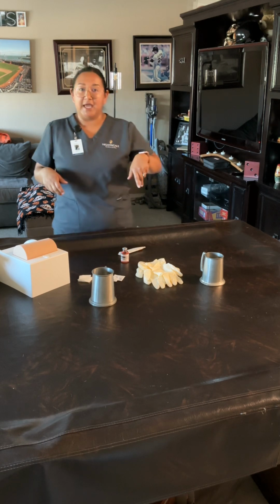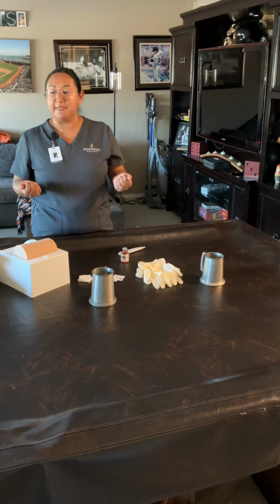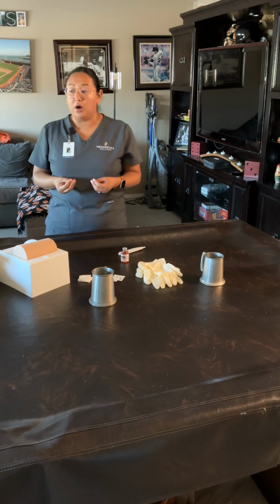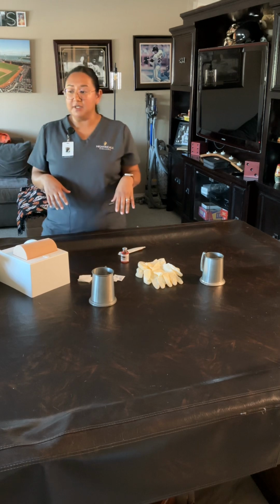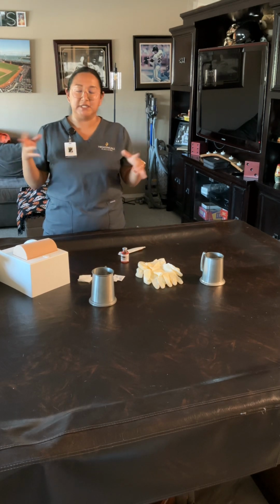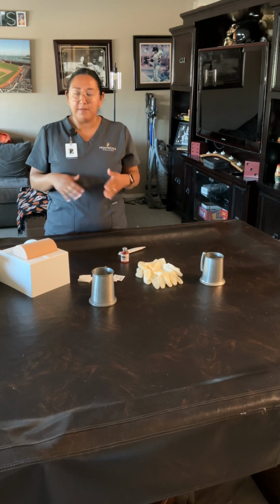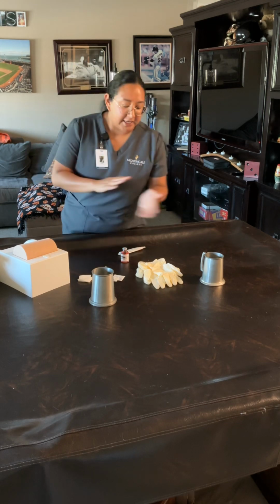Let them know that this is a heparin injection and it's used as a blood thinner, and it actually prevents blood clots from forming in your blood vessels. And common side effects that can happen are easy bruising and increase of bleeding, just in case you get a cut or a scrape. And just normally with injections, you can feel some burning and stinging, but that should resolve very quickly. And so perform hand hygiene there.